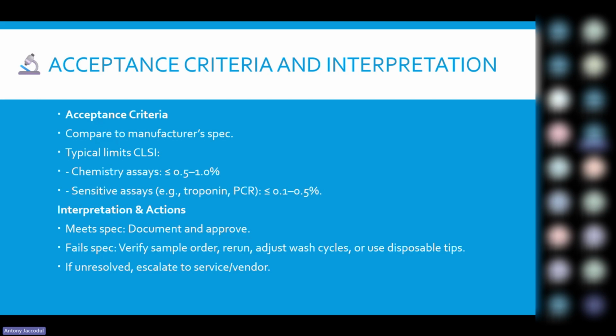So you'll find 0.1 to maybe 0.5 is acceptable for certain tests. So you need to consult your inserts so that, once you calculate your carryover, you either accept or reject whatever you've calculated, and you're able to see that this machine might not be fit for use for certain tests. Therefore it's a very important component if you look at it.